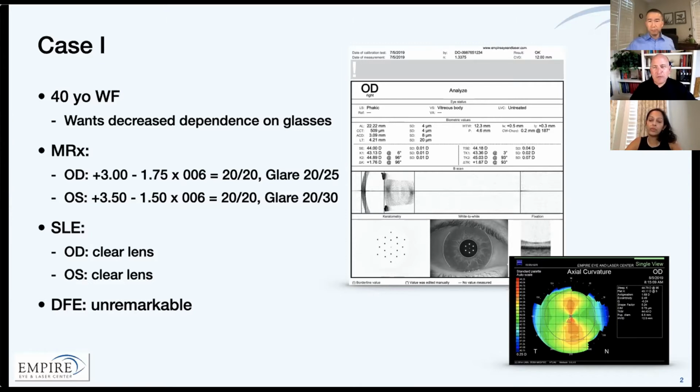And it's really refreshing, isn't it, Daniel? Here you got a young patient with a pretty nice looking topography. Everything looks pretty clean with these measurements. So I'm guessing you didn't have a whole lot of dry eye to clean up in this case.